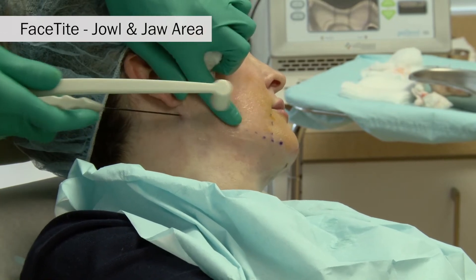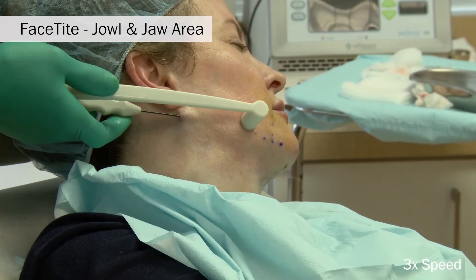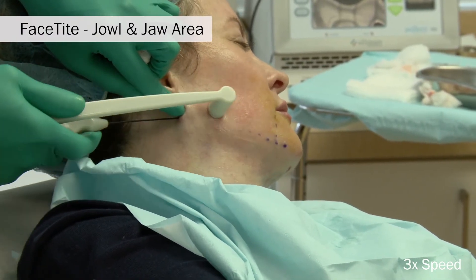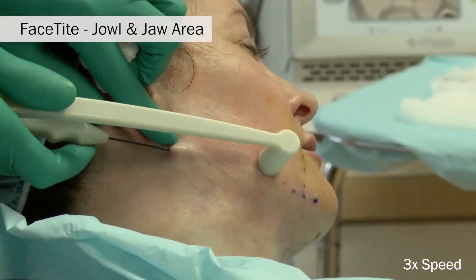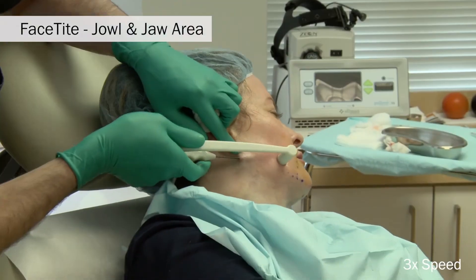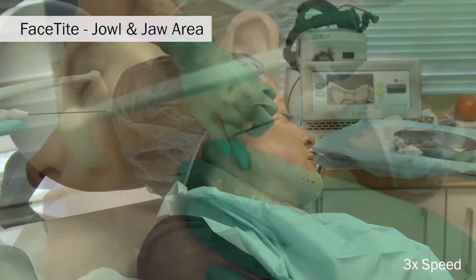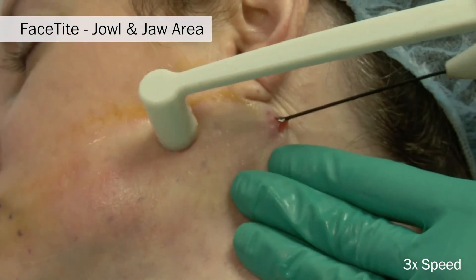Finally, treatment of the jowl and jawline area is performed. It is of utmost importance that you stay immediately subcutaneous in this area and do not dive deep into the jowl. Treatment proceeds from laterally all the way up to the marionette line. You do not want to dive deeply into the jowls due to the risk of injuring the deeper marginal mandibular branch of the facial nerve in this area.